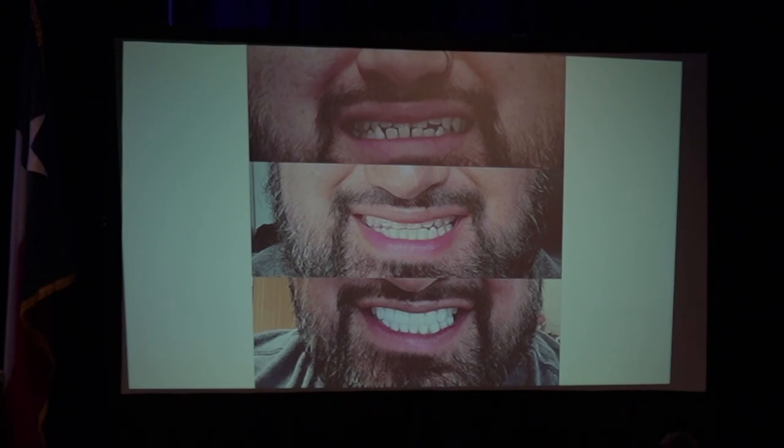That's the second video of his bite. So we didn't jump the bite fully. Sometimes you don't jump the bite fully, you're going to open up the bite and you can do it with the prosthetics. And that's how you get it. So you can do a complicated case with digital dentistry. I know I can do it because of the whole design process I'm teaching you guys. If you guys want to learn more about it, we'll go more in depth. But I'll tell you that if you overpromise and overdeliver, I guarantee you're going to sell a lot more cases.